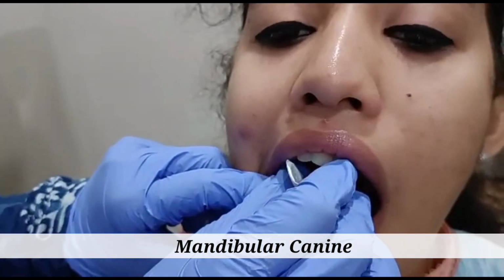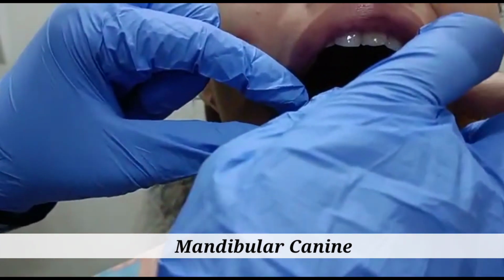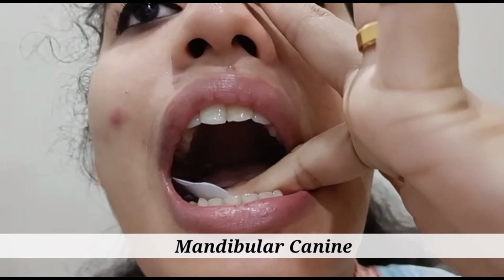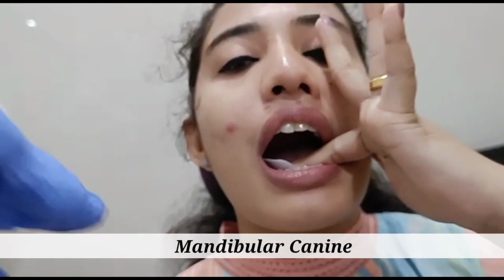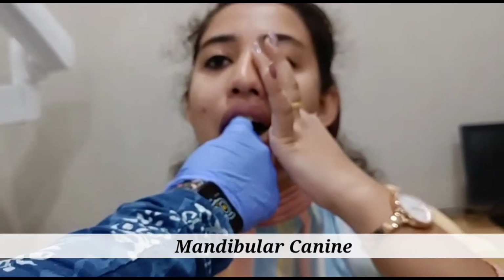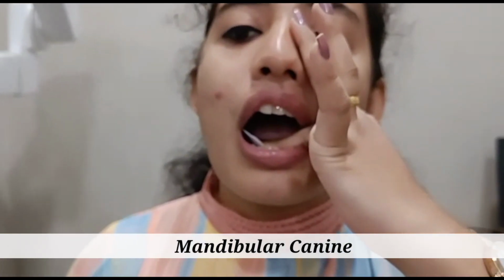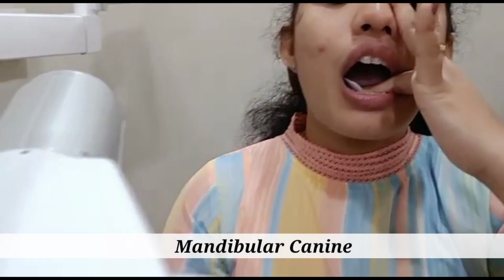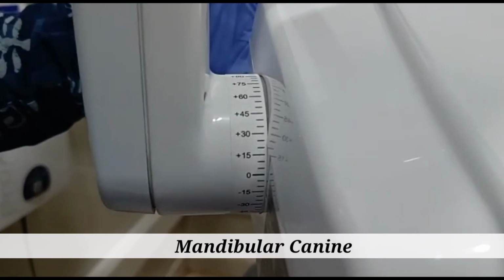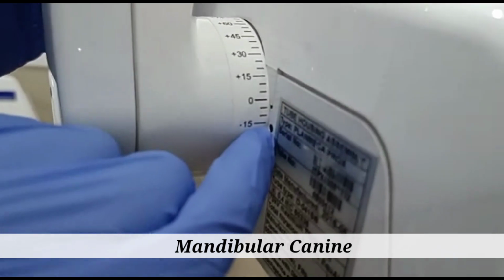such that the occlusal dot coincides with the cuspal edge of the canine, and the inferior surface of the image receptor must touch the floor of the mouth, or else we won't get the apical portion of the canine. So always remember, you have to touch the floor of the mouth. Sometimes the patient might fidget with the image receptor and place it quite superiorly, and we will get an apical cutoff. So you always have to make sure that the inferior surface touches the floor of the mouth.